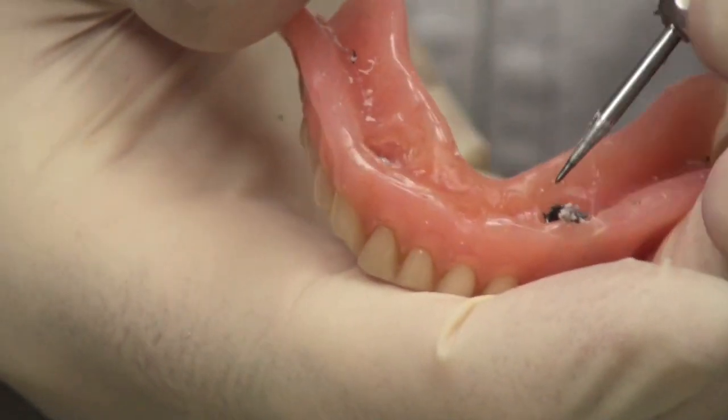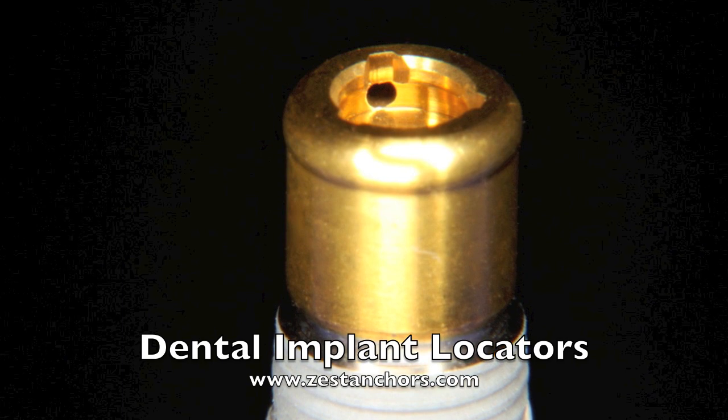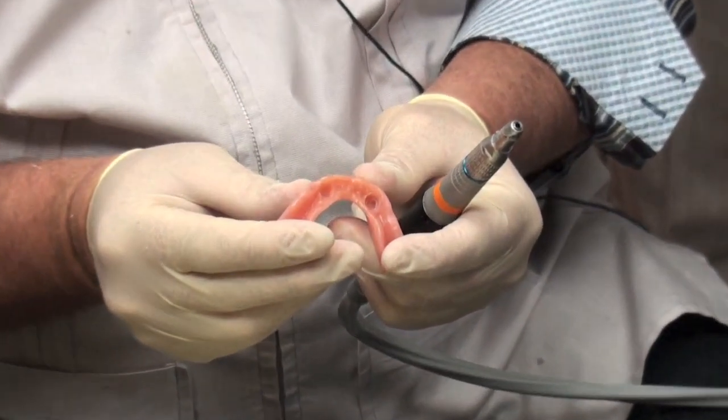Here we are taking out the old ball attachment housings. These can be easily removed with a diamond — a very tapered, slender diamond.